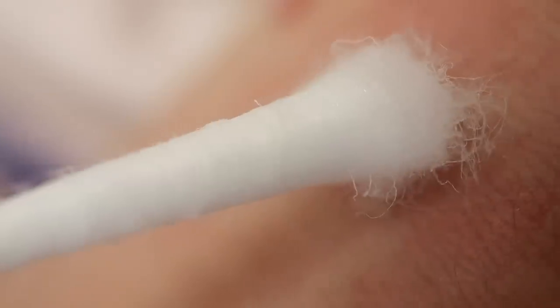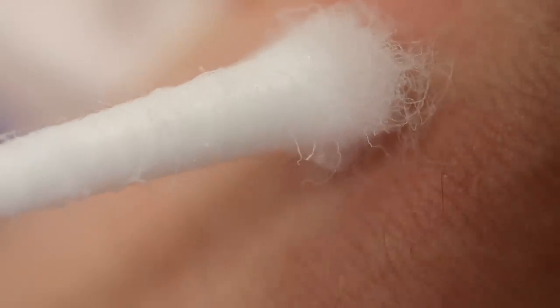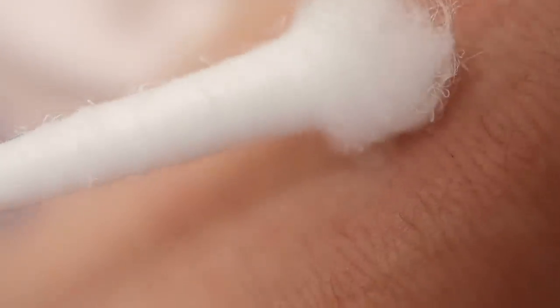How close into the camera? I can't tell you. Still for you. You're about two inches. It makes funny noises, doesn't it? So the goal there is to get a little bit of normal tissue frozen.